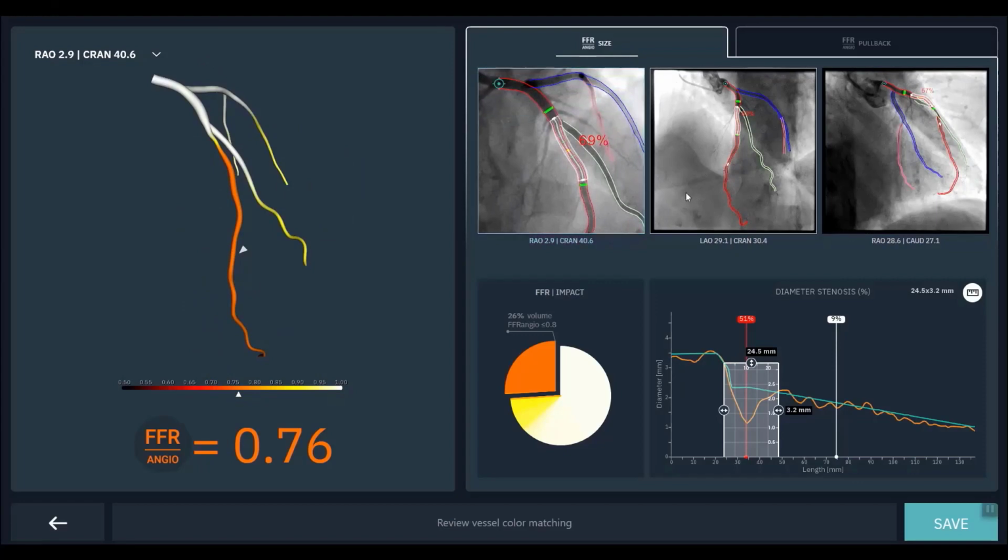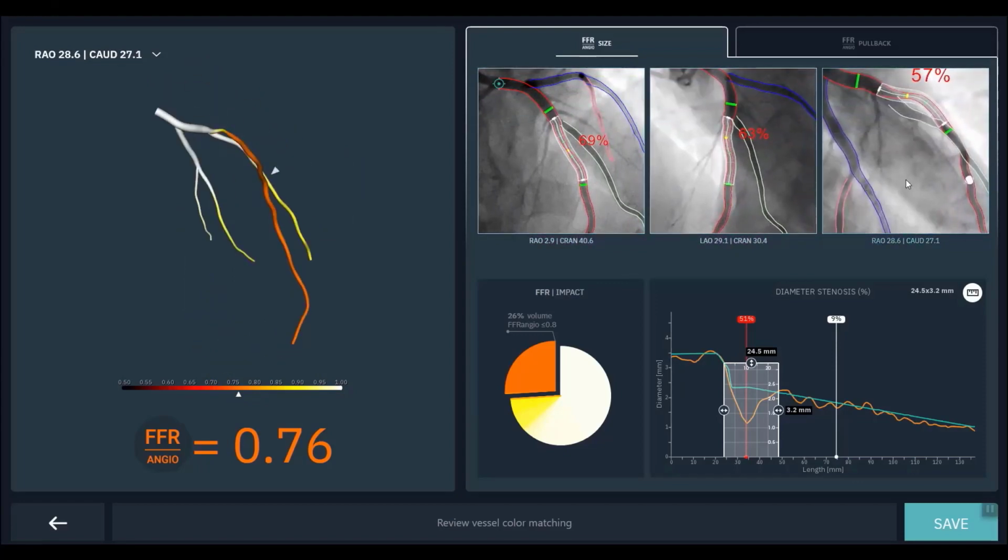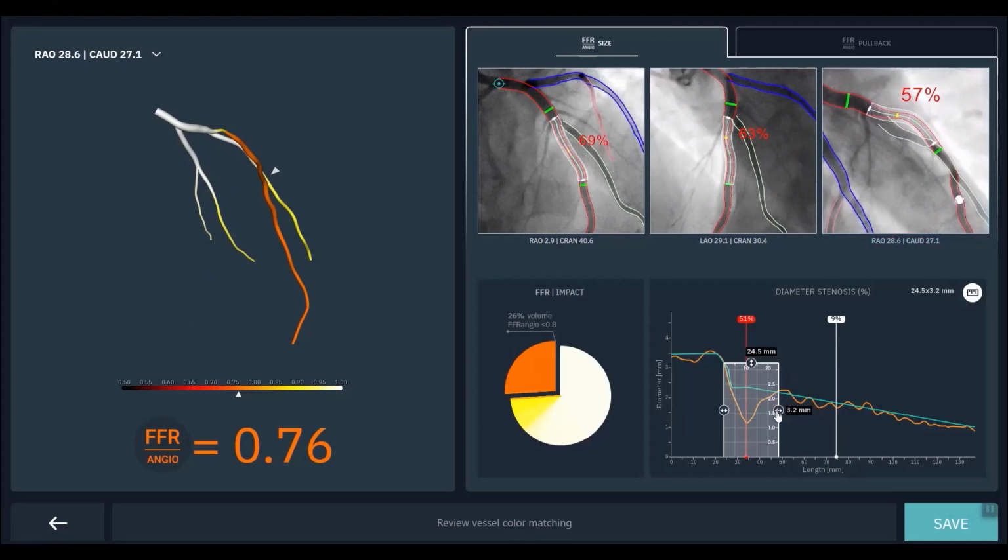Now zooming in on the area of interest, you can see there's the overlaid stent in that segment. And we can manipulate that and say, okay, let's make the stent slightly longer because we want to go from normal to normal. And it's showing us on that rendering above what that will look like on the coronary angiogram. So if we decided, for example, we don't want to cover the side branch or we're happy to cover the side branch, we can make those manipulations here to help guide what we're going to do in terms of procedural planning.